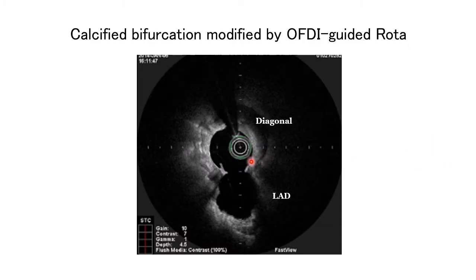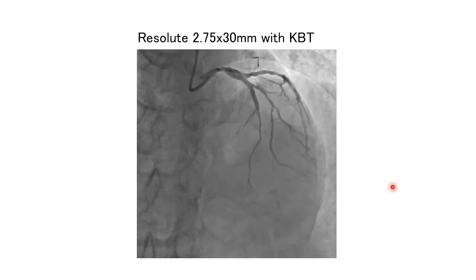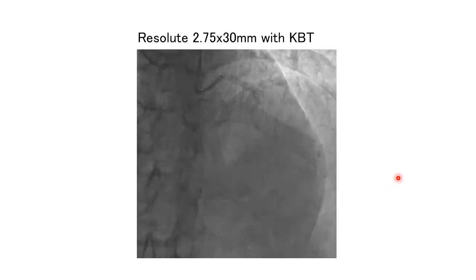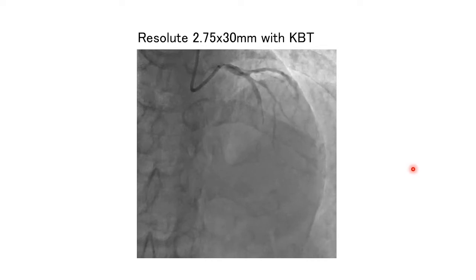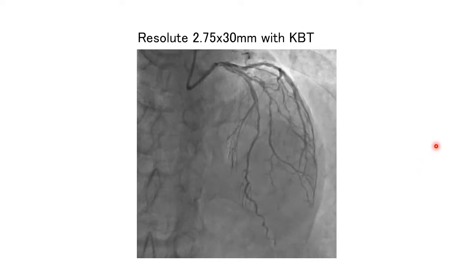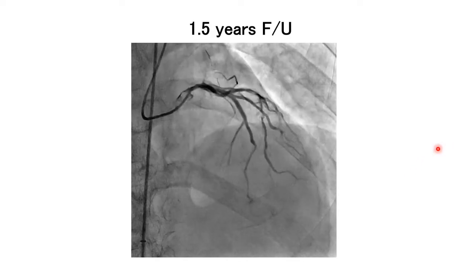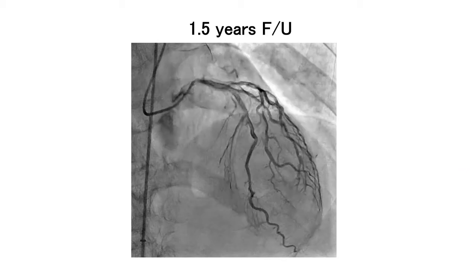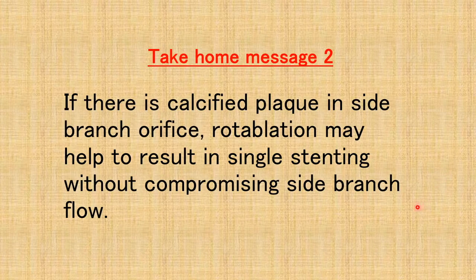OCT shows that the orifice of the diagonal branch still has calcium, but lumen gain looks okay. We implanted a Resolute stent 2.75x30 into the LAD and finished with KBT. At 1.5 years follow-up, no restenosis was observed. Rotablation may help achieve single stenting without compromising side branch flow.